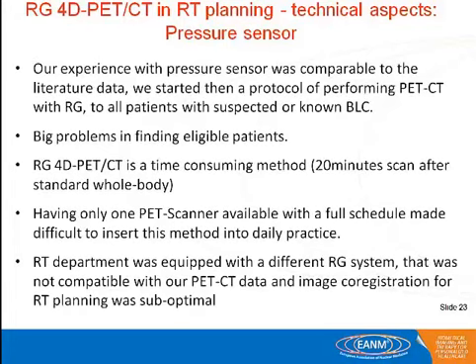Well, we have an experience that's comparable to literature data, and the protocol was to perform PET CT with respiratory gating on all patients with suspected disease. But we really had big problems in finding eligible patients because sometimes they come for a diagnosis, sometimes they come for an accurate staging. So it was difficult to find patients for that. It's really time consuming, more than 20 minutes just for the bed. And at the time we had only one PET scanner available, so with a full schedule it was difficult to insert this method in daily practice because we have to plan it the day before. It was really difficult to find eligible patients the day before.